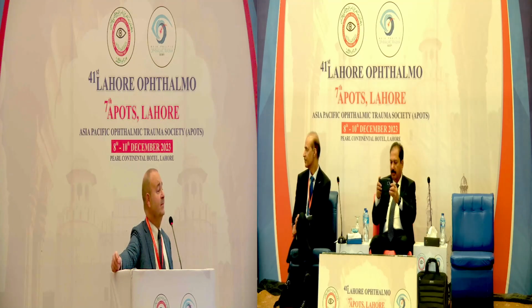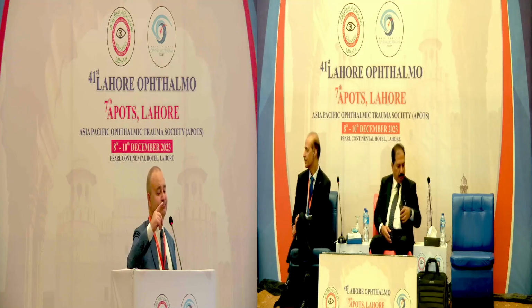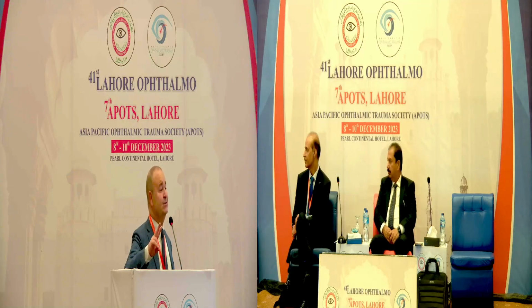If you are in trouble, you can use Yamane. But the Yamane uses a standard 3-piece lens, 6 millimeter optic diameter. Which is the problem? The problem is that it has much more risk of tilting and much more risk of decentration.